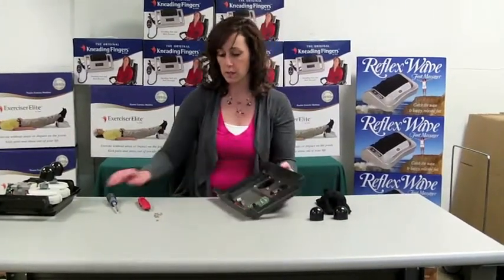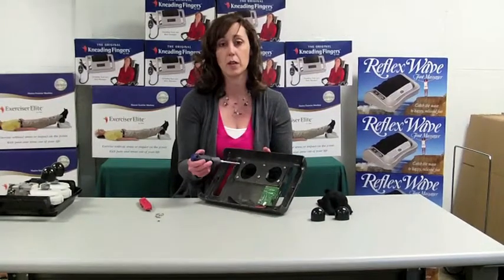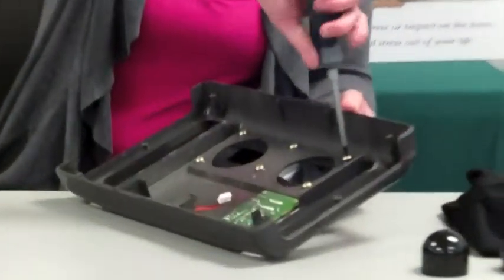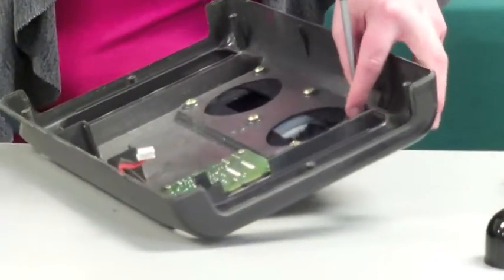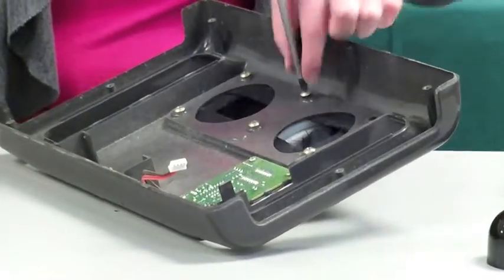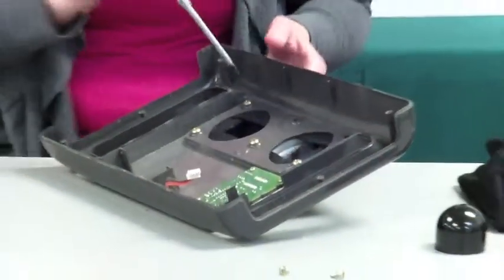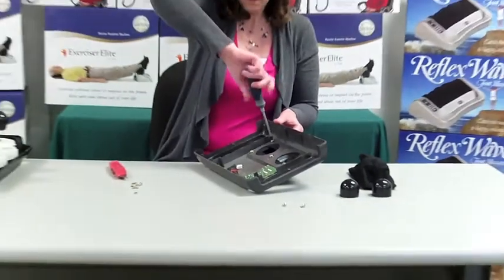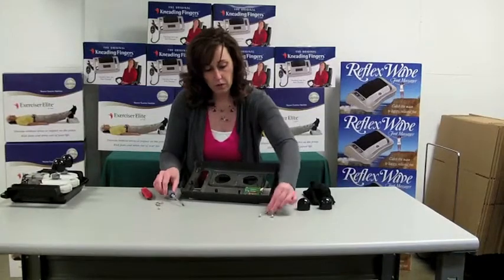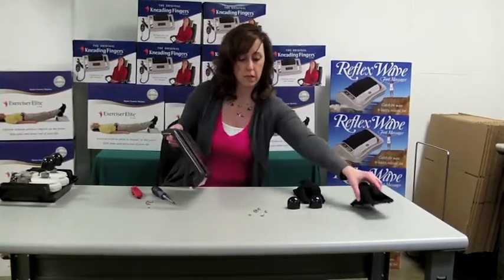The next step is to remove the screws. There are six screws that hold the fabric in place, so we will take our Phillips head screwdriver and remove those. Note that the size of these screws that hold the fabric on are a little bit larger than the ones we previously took out, so you'll want to keep them separated. Your old fabric will just pop off of the cabinet and you can discard that.